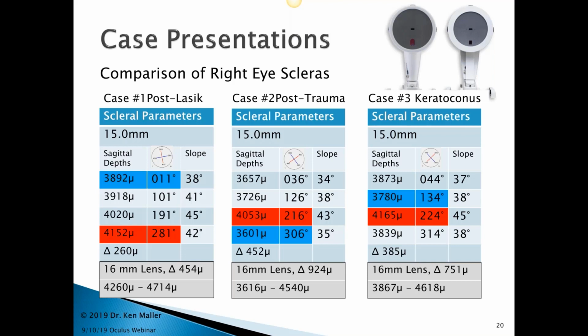Okay, great. Thank you. I guess we only have time for about one more question. So I apologize to all the questions we didn't get to, but our last question is, can you replace the corneal topographer if you have a Pentacam? Depending on the corneal topographer that you have, I believe you probably could.